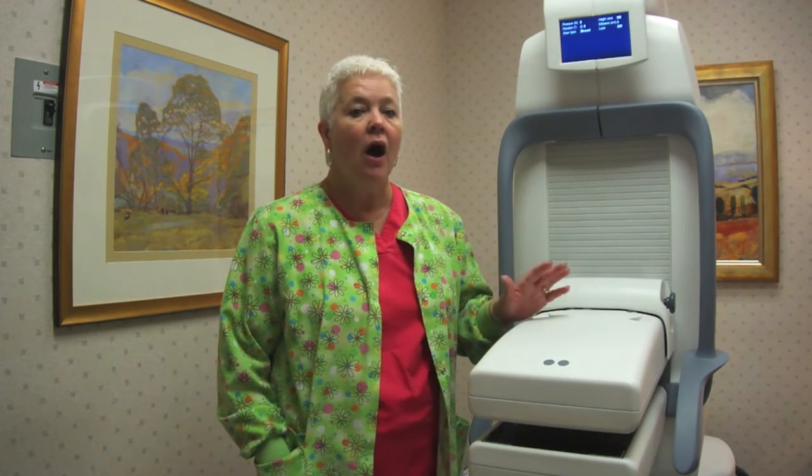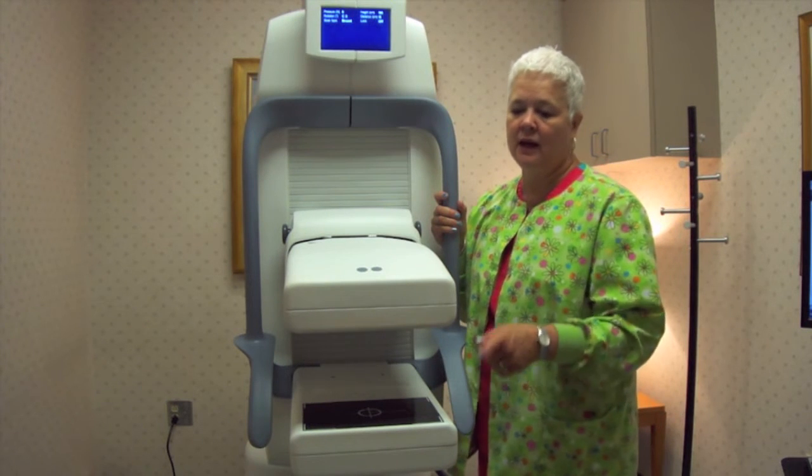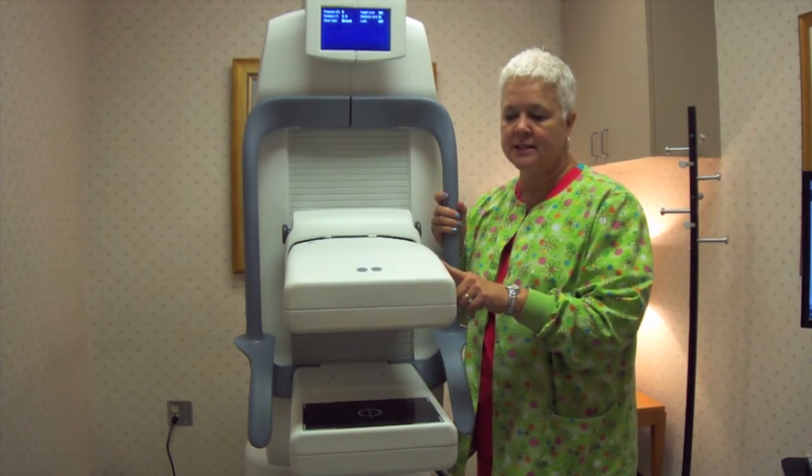It takes about 40 minutes to do the exam. It's similar to a mammogram in positioning; however, we do not compress your breast. We only place your breast onto the image holder, and we hold it still and stable for about a 10-minute exposure, for a total of four exposures — more if we need them.